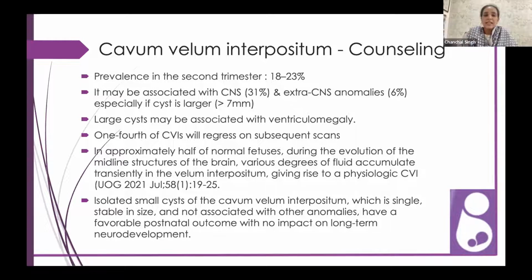Yes. So I think, as I said, with increasing resolution and with increasing use of transvaginal scan, we are seeing these findings more and more often, and that is why literature is also coming in recently. As Dr. Savita rightly mentioned, it is various degrees of fluid accumulation in the velum interpositum, which gives rise to physiological CVI.